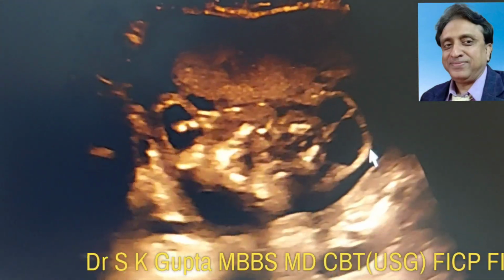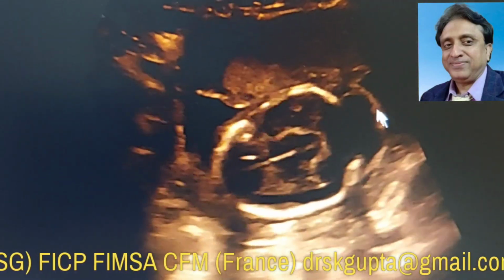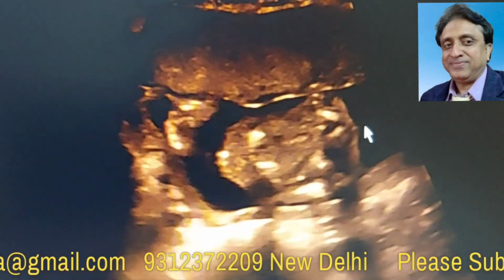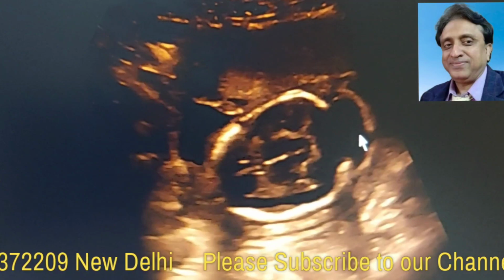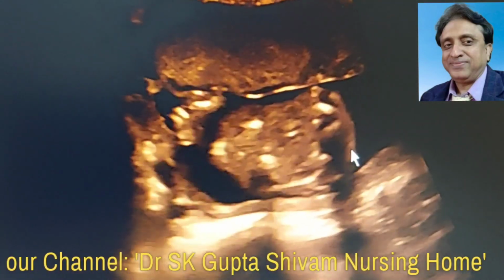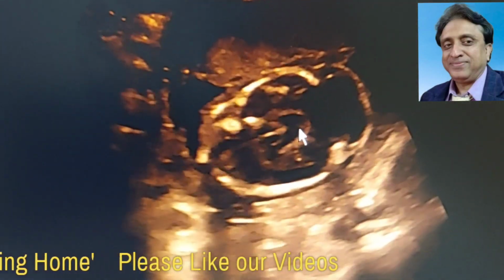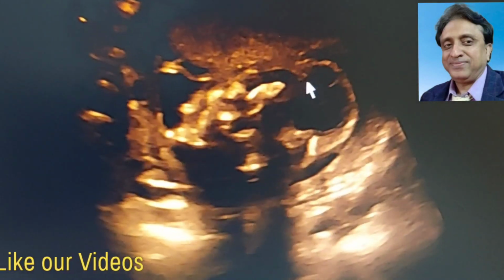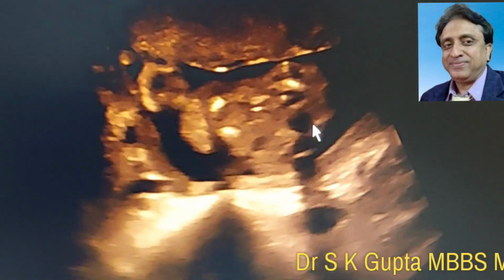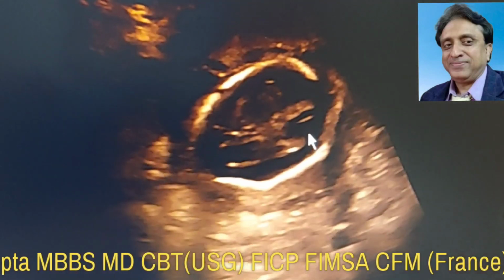And you can see that the density of this skin or the tissue of the cyst is much lesser than the density of the bone. So this is not the bone which has been shifted outward, but this is the bony defect in the occipital part of the brain, and it is nothing but the cerebellar encephalocele. If I try to see the things in detail, I find that this is the thalamus, which is normal, in the third ventricle over here, but the fourth ventricle and the cerebellum cannot be seen. It means the cerebellum along with the meninges have herniated through the cyst into the neck of the patient.